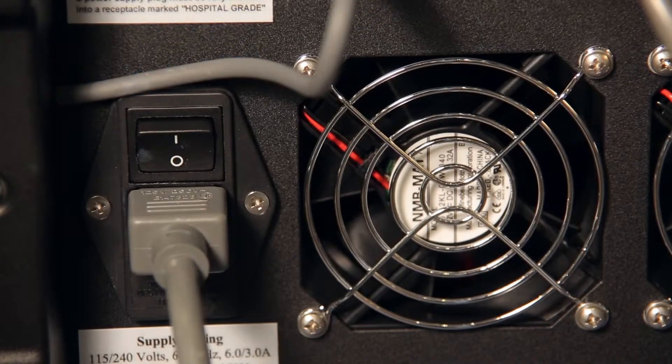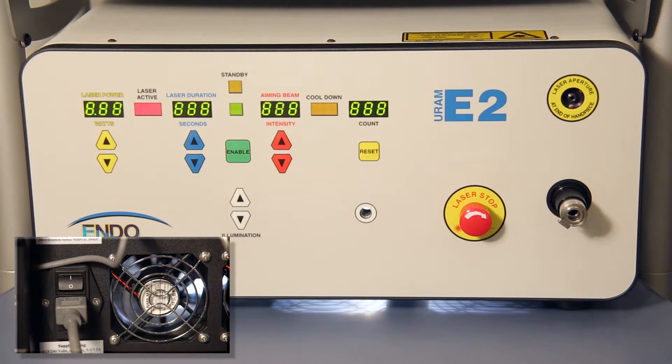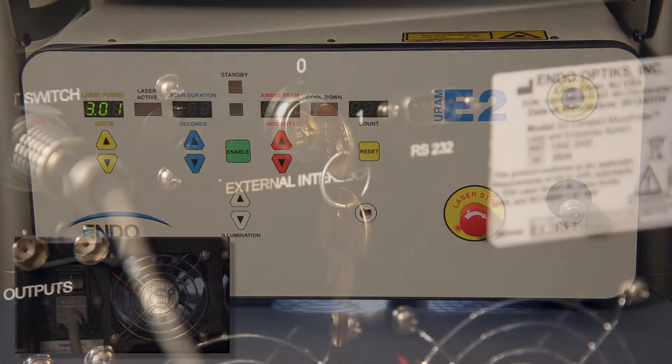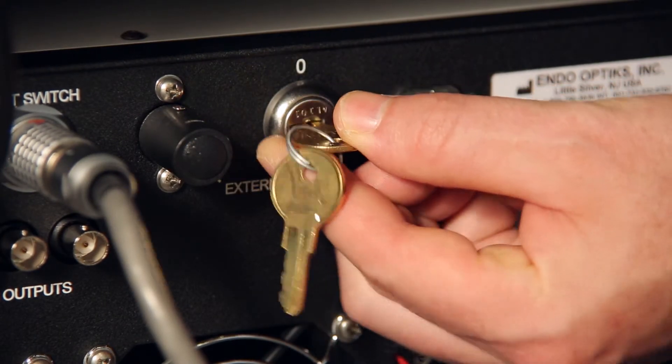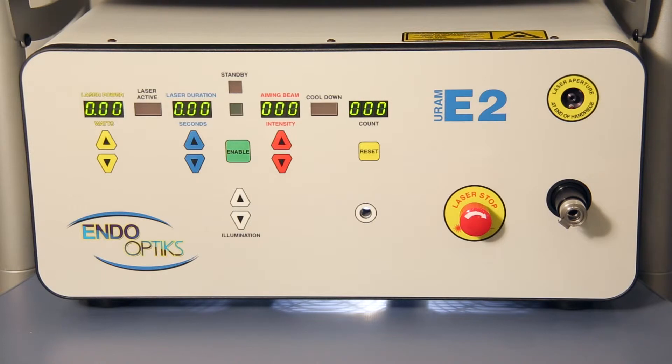The power switch for the E2 console is located in the back of the unit, directly above the power cord. You can now switch it to ON. While behind the unit, be sure the laser key is inserted and turned to the number one or horizontal position. The front control panel will not work if the switch is not turned fully to 1.